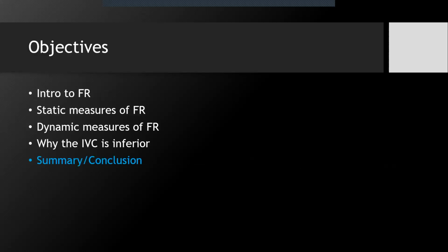What I haven't discussed in this talk, which is not for today, is diastology and VExUS. These are also semi-advanced echo techniques that are used to assess not so much fluid responsiveness, but whether you're fluid overloaded or congested. If diastology or VExUS shows that you're fluid overloaded, that would probably be a sign not to administer fluids. It's getting at fluid responsiveness from the other direction, proving that you've already overshot. Something to be aware of, but we're not discussing those today.